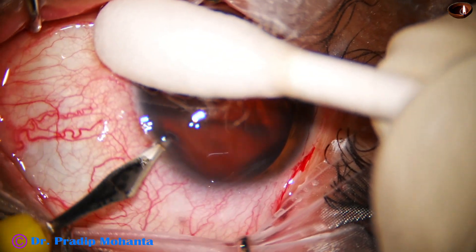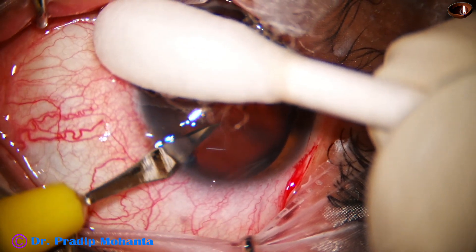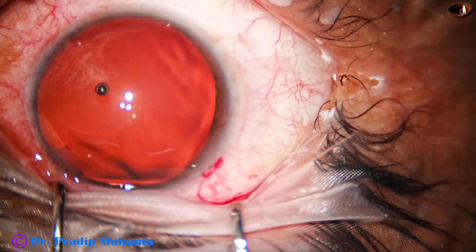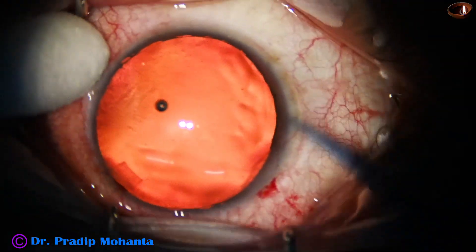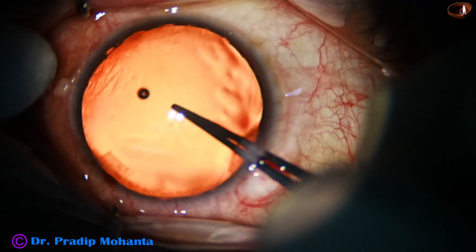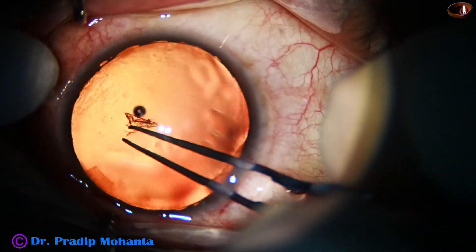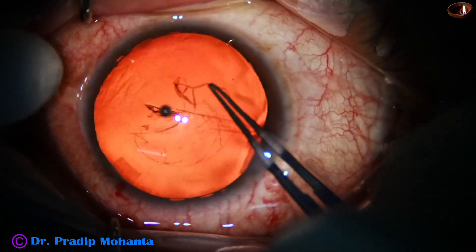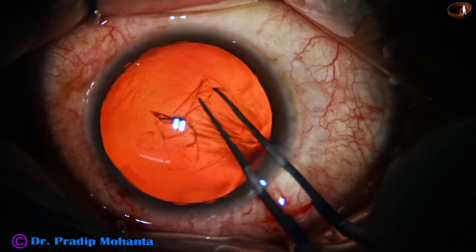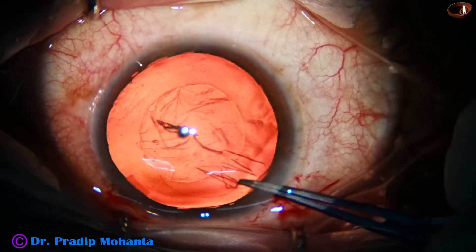This is a side port on the left side of the main incision and now capsulorhexis is to be done. At this time, we must remember that the pupil is dilated much and the rhexis has to be of adequate size — about 5.25 millimeters.